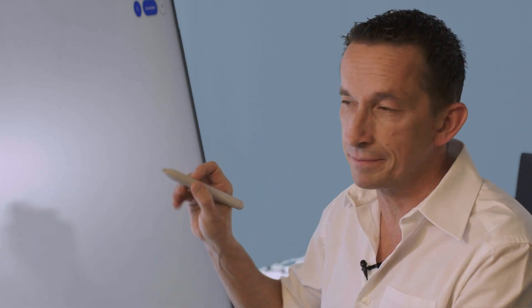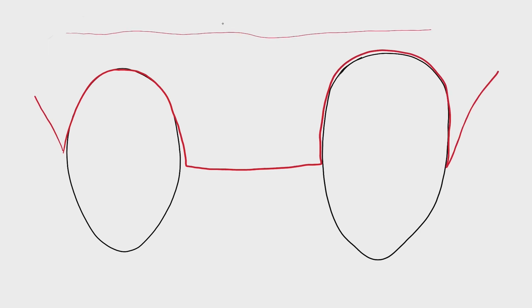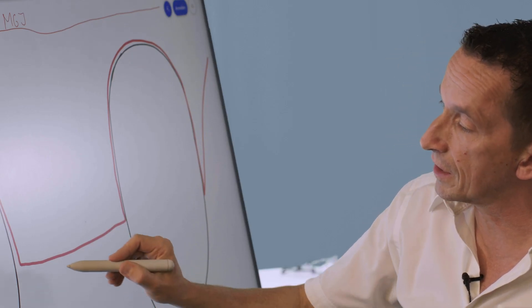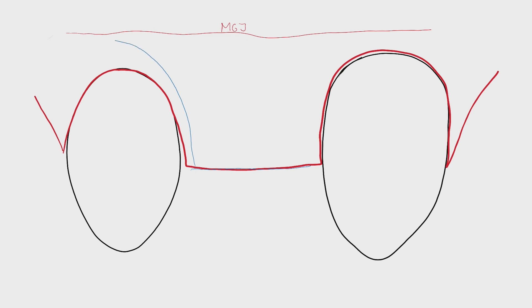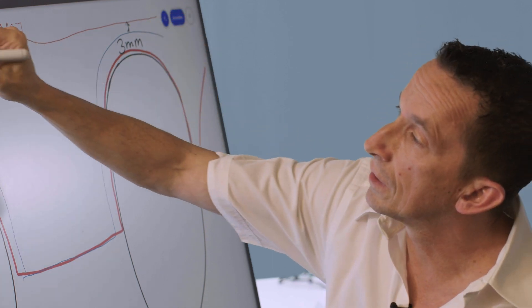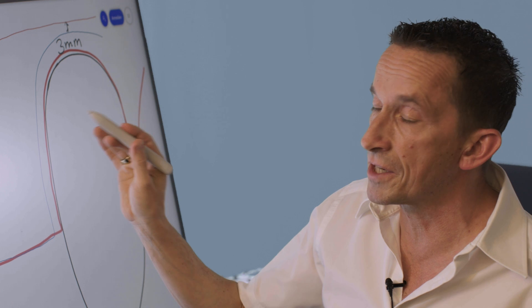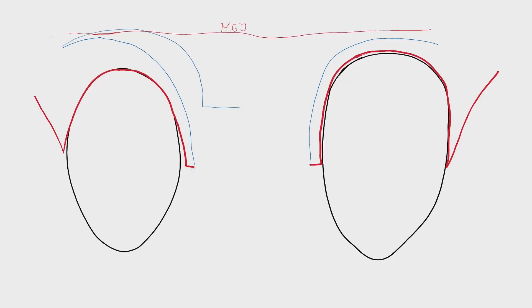Let's have a look from the buccal side. In this area we have the mucogingival junction. The flap design comes from the palatal aspect — we keep the papilla and stay in the keratinized tissue, so we have a minimum of three millimeters here and here, and we still have keratinized tissue on the other side of the flap. The advantage of this technique is to gain keratinized tissue. After raising the split thickness flap, in the end it should look like this. This part heals by granulation.